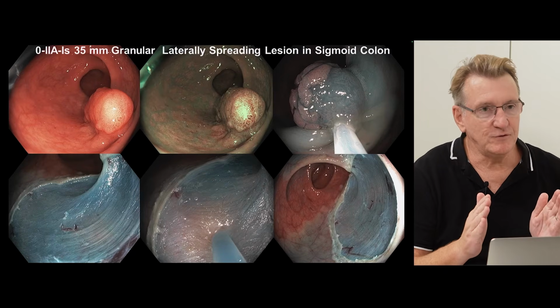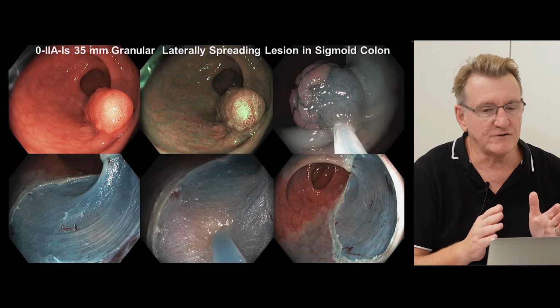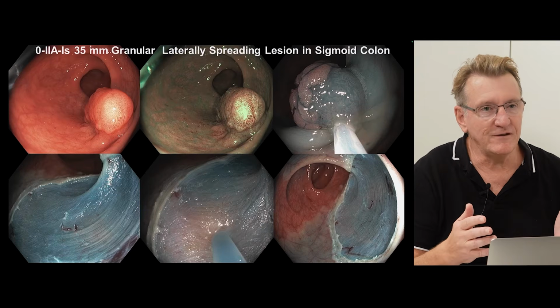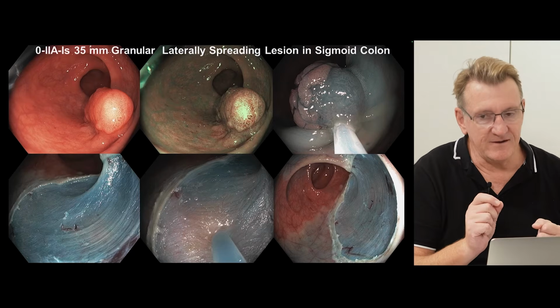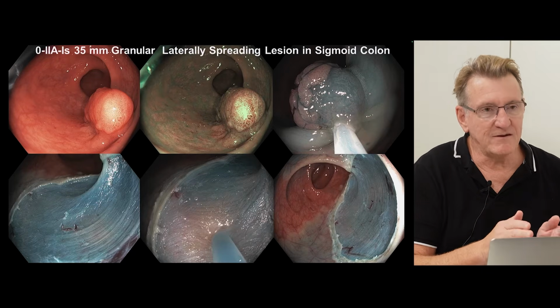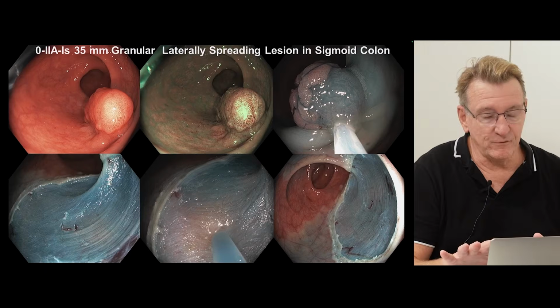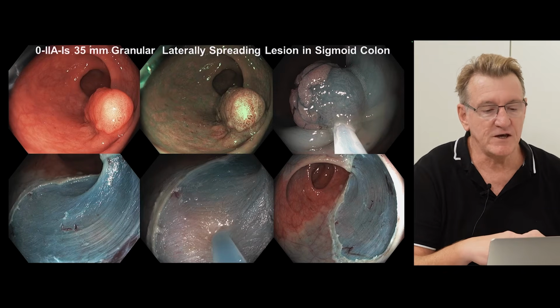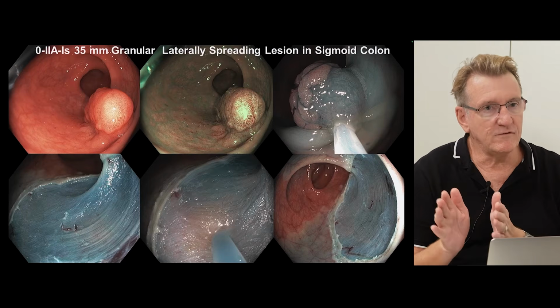But what you really should do, because it will happen, avoiding perforation in complex resection, of course you can do things to avoid perforation, but like adversity in life, it's inevitable. There will be perforations. The key thing is how you respond and whether you recognize them. What you must do at the end of every procedure is look at the defect very carefully, expand it fully with the water jet or by further injection and gas insufflation with CO2, and take extensive images, a lot of pictures, because they're going to serve as your record.